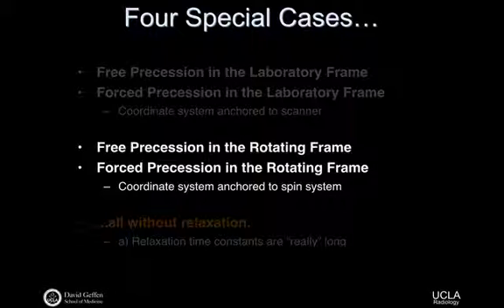Okay, so the next step is that we want to define the B effective in the rotating frame. So how do we go about doing that? Okay, we saw this a second ago. We said that the B effective is defined as omega rot by gamma plus B rot. Unfortunately, we just figured out what B rot is, or at least we figured out the B1 component of that.